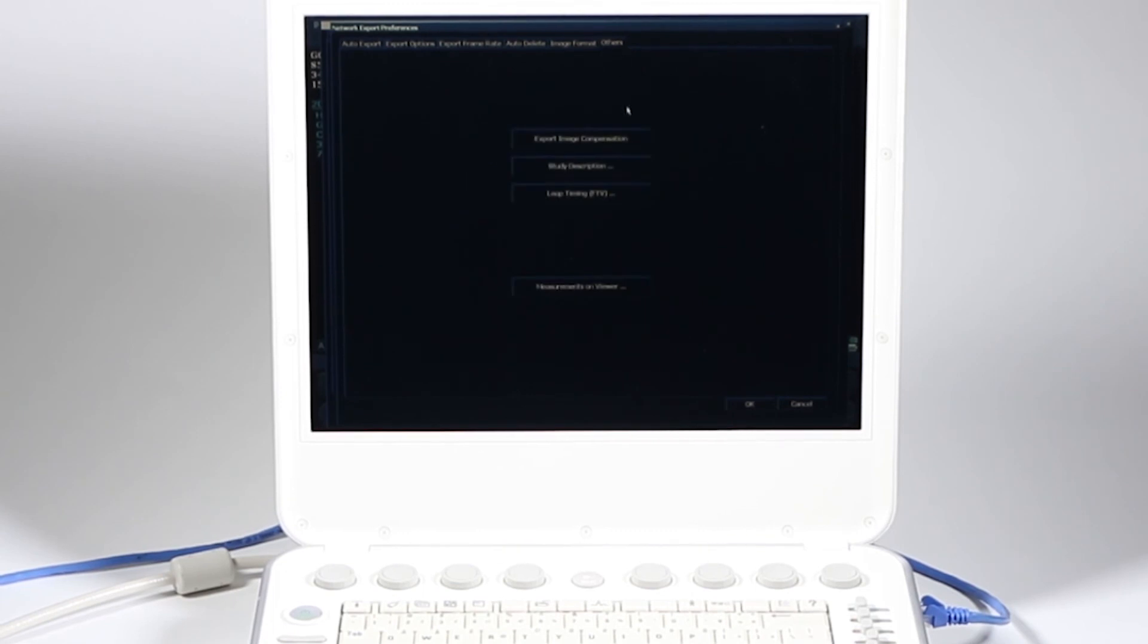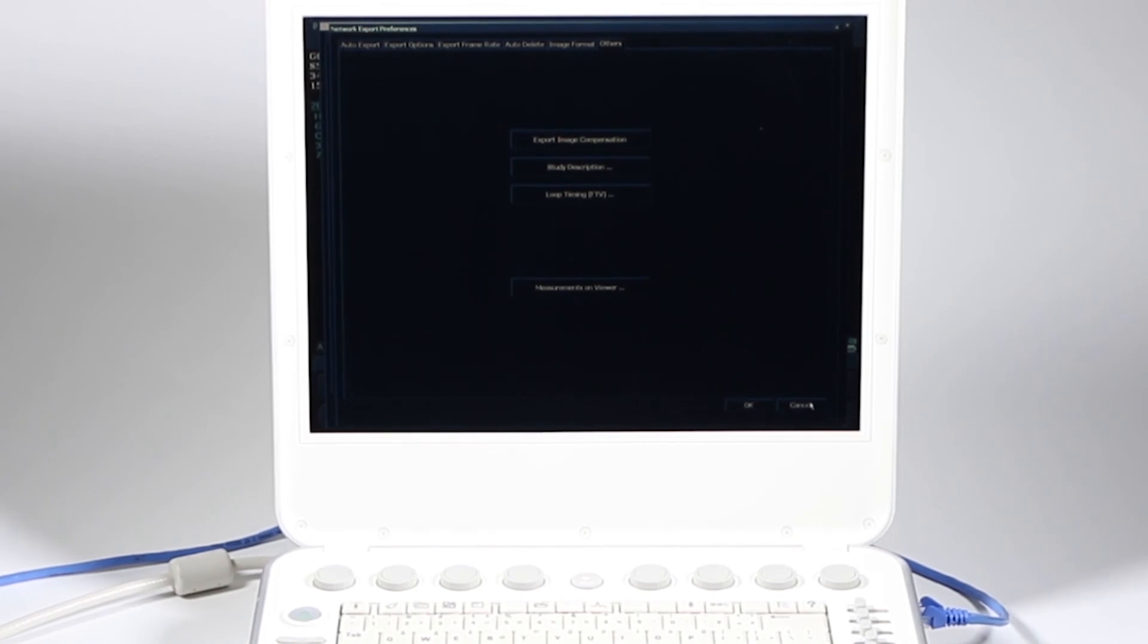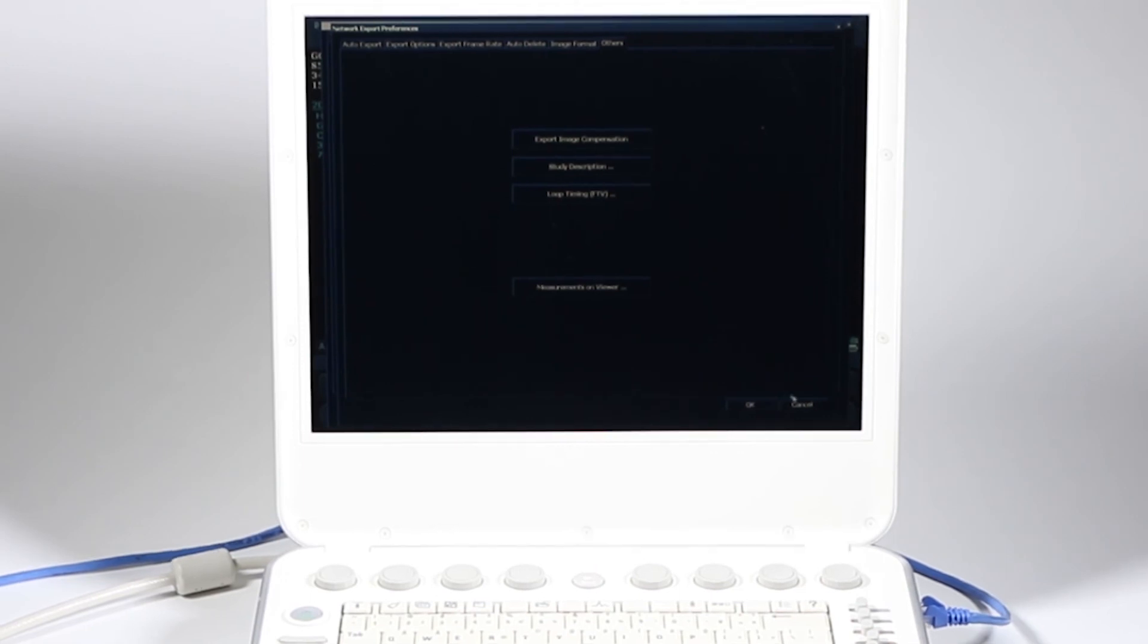Export image compensation, loop timing, et cetera, you could take a look. And if there's anything in there that you want to change, go ahead. But in general, those defaults are fine. I'm going to go ahead and click OK.